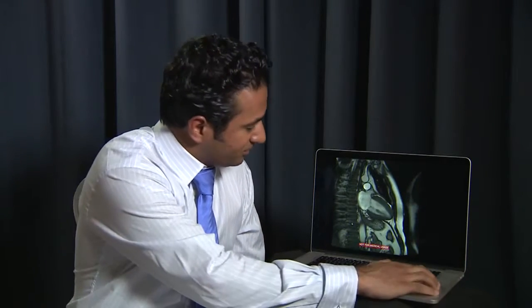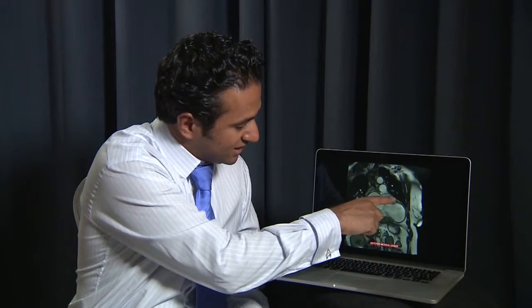By looking at this we can answer a lot of questions — how well is the heart doing? In this example, if we compare it to the previous examination, we can see that the anterior wall here is very thin and is not moving at all. We know this patient may have sustained a heart attack in the past, and what the clinician would want to know is: is it worth revascularising?